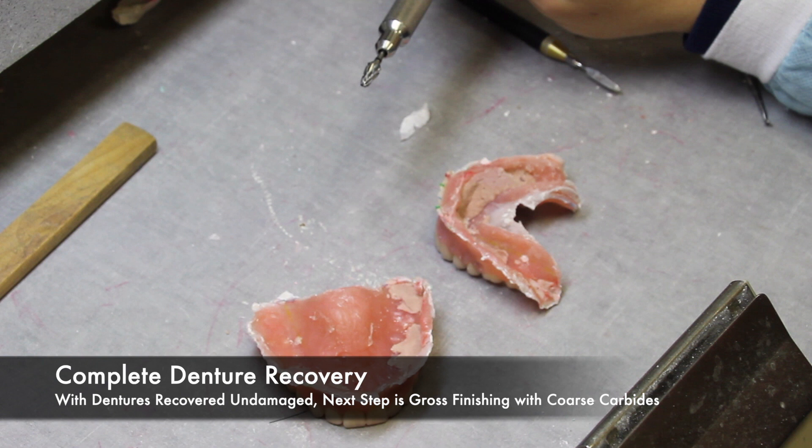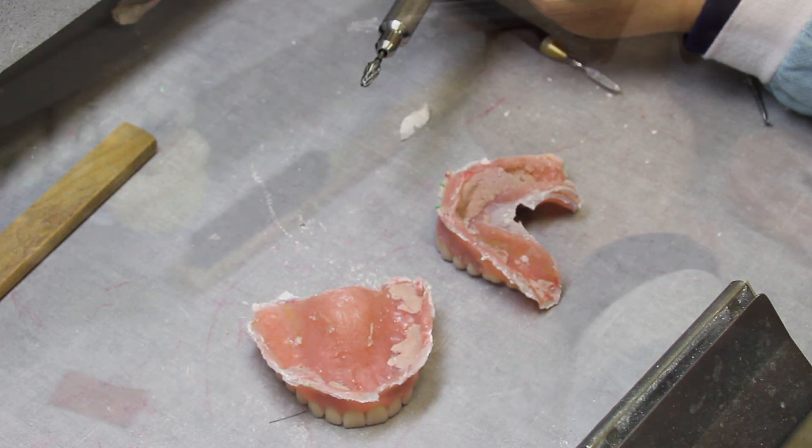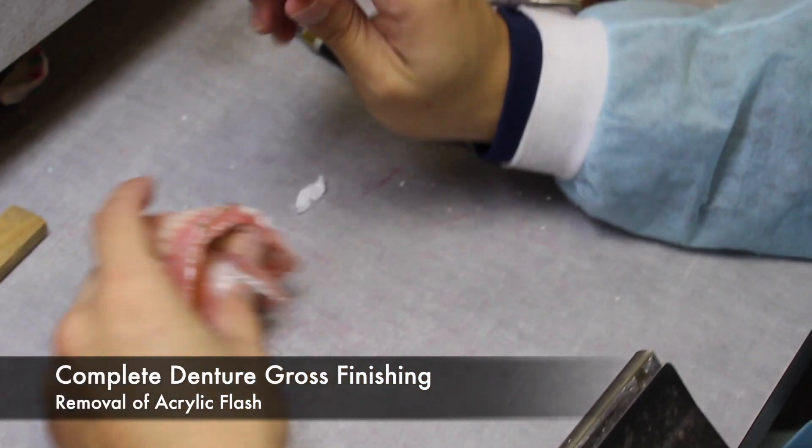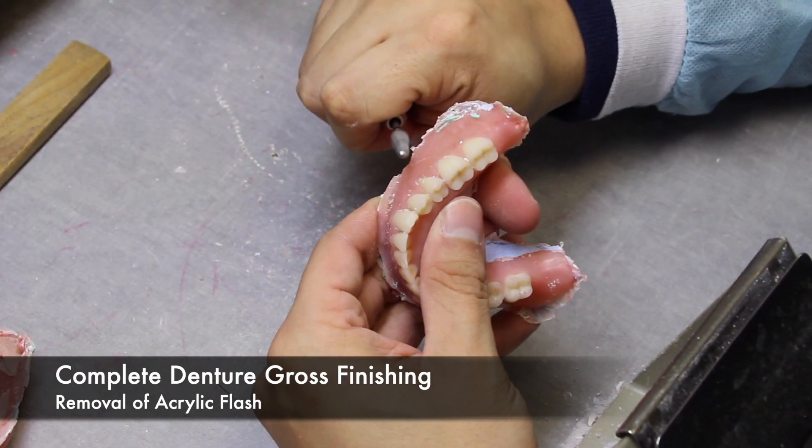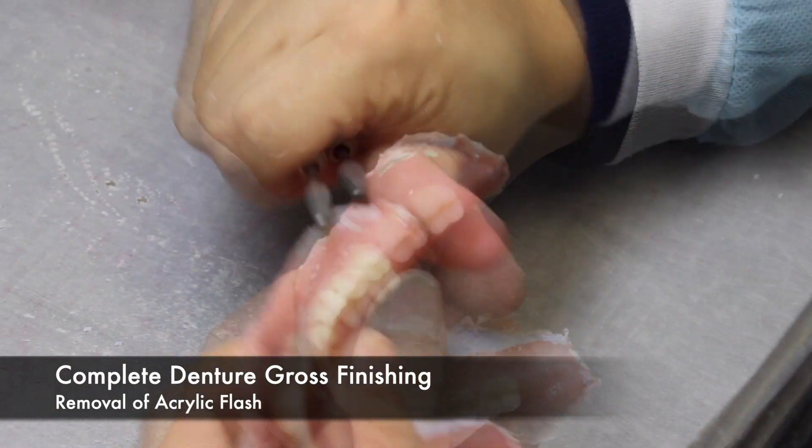Once the dentures are safely removed from the model, it is important to remove the flash as soon as possible. The acrylic flash is so sharp it can cut skin. This brings us to our first step in gross finishing: the removal of the acrylic flash, done with a coarse carbide burr.